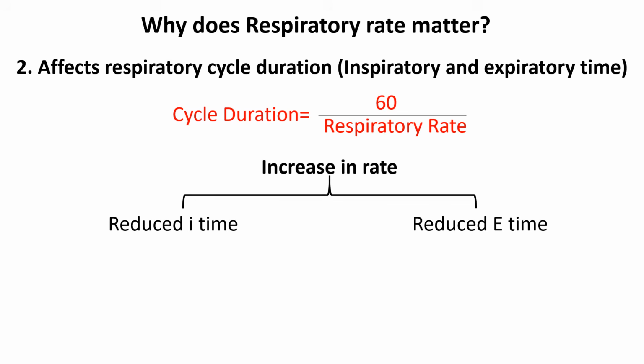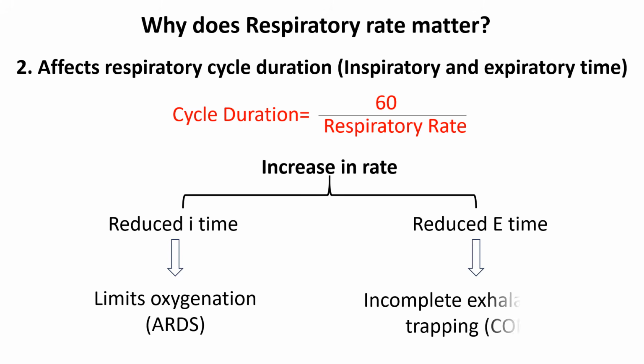Reduced inspiratory time may limit lung filling and affect oxygenation in conditions like ARDS. A reduction in expiratory time can lead to incomplete exhalation and air trapping, particularly in conditions like COPD, where airway obstruction limits exhalation.